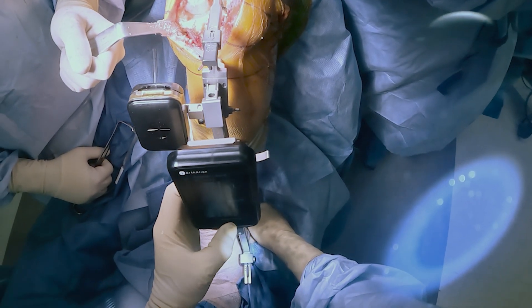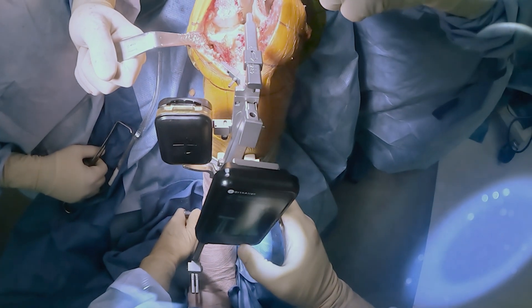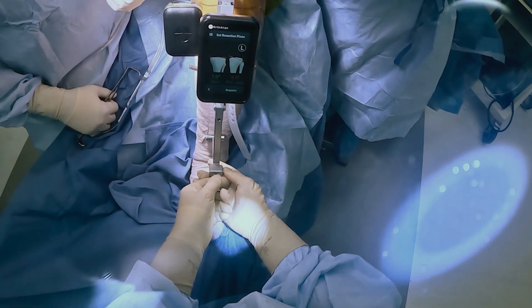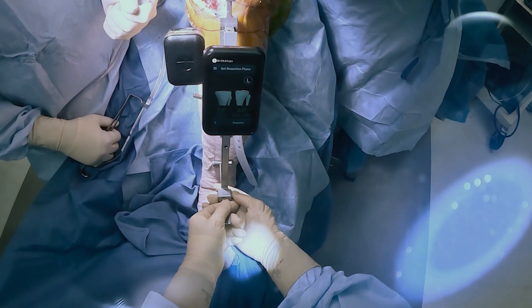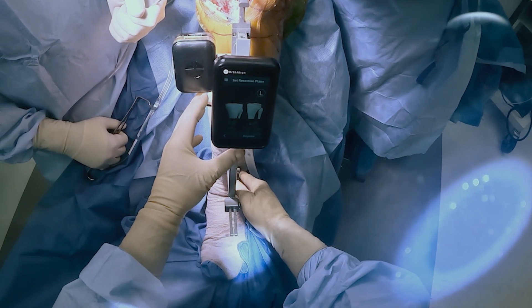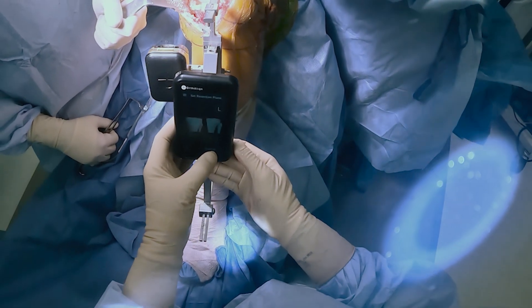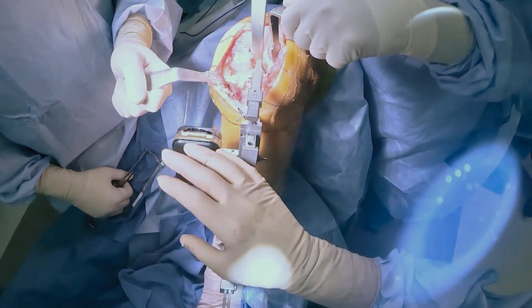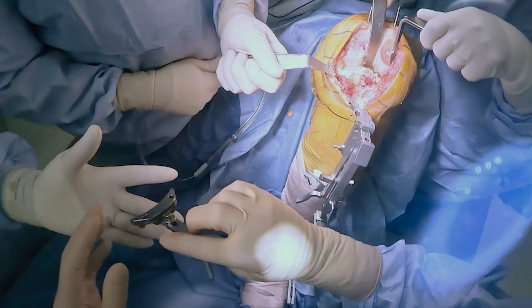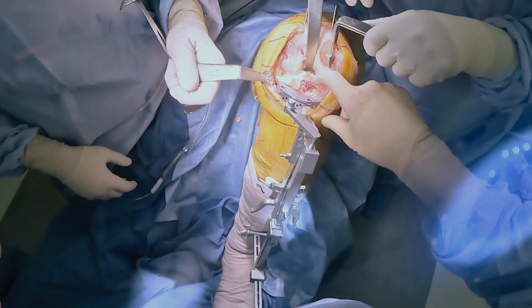I personally think that the tibial registration is the easiest part of the process. The tibial jig is attached to the proximal tibia and I'm registering the medial and lateral malleolus. We've already accounted for offset, which allows us to create a mechanical axis. This takes me approximately two to three seconds to do this whole process. I personally will adjust the varus valgus slope according to the patient's knee as well as the deformities that I'm working with. This workflow is actually faster for me than manual instrumentation because I trust the system so much and have a significant amount of confidence with the readings that I'm getting on the computer screen as well as in real time.